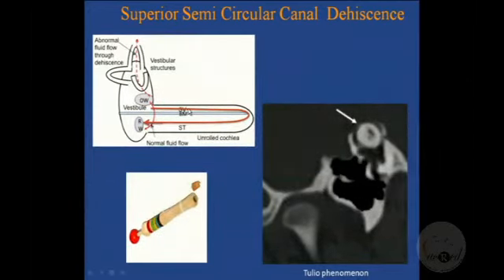It's almost like if I drill a hole into this tubing here, can you really pop this gun? You can't. Your sound waves are going elsewhere. So to keep it simple, you're looking for dehiscence. It could be congenital or acquired. Acquired could be any erosions due to cholesteatoma, or it could be traumatic, post-traumatic fractures and things like that. So that's about semicircular canals.